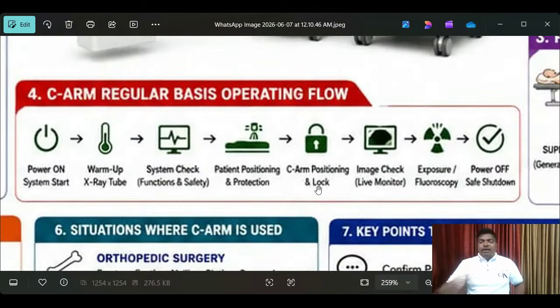Okay, right, come on. Now operation flow, see here. See, I'm showing you and I am observing you and giving information. Why? Because both are very, very important. Understand? By seeing many things we can learn, by listening we can learn, and by following the instructions of seniors we can learn many things. Understand? In a single way we cannot do anything. We have to depend on one another.